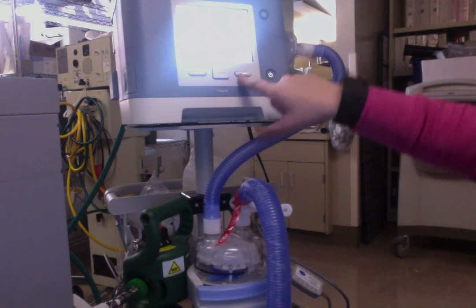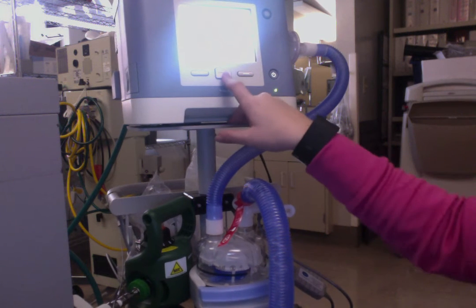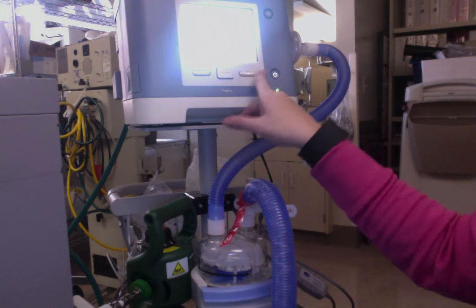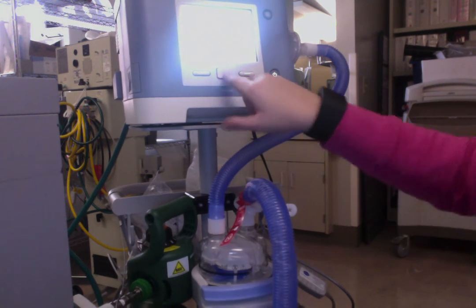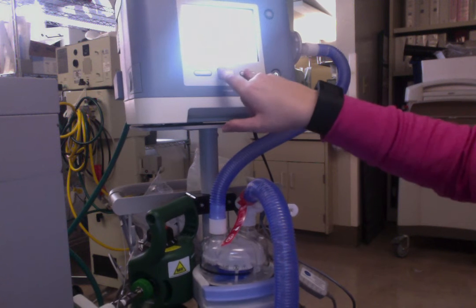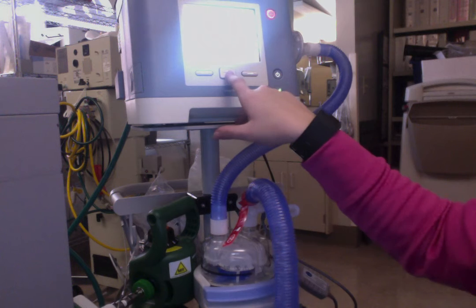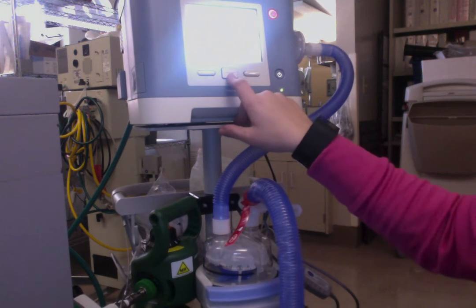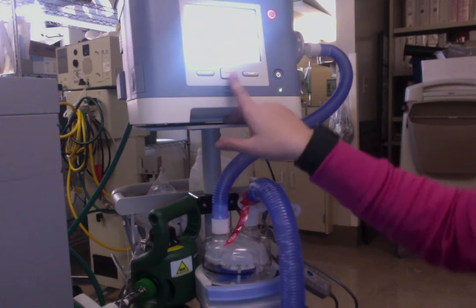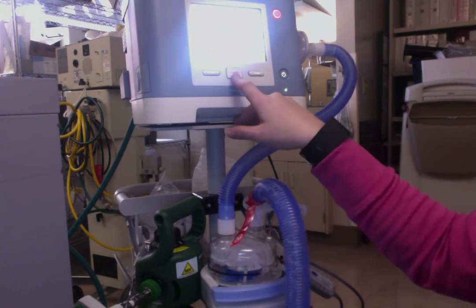To change settings, you're going to hit the modify button and then just go down as you want. I have it in spontaneous timed mode. My IPAP is set at 16 and my EPAP is set at 10. My backup respiratory rate is at 16, my I-time is at 0.8, my FiO2 is set at 60%, with a rise time of 3.